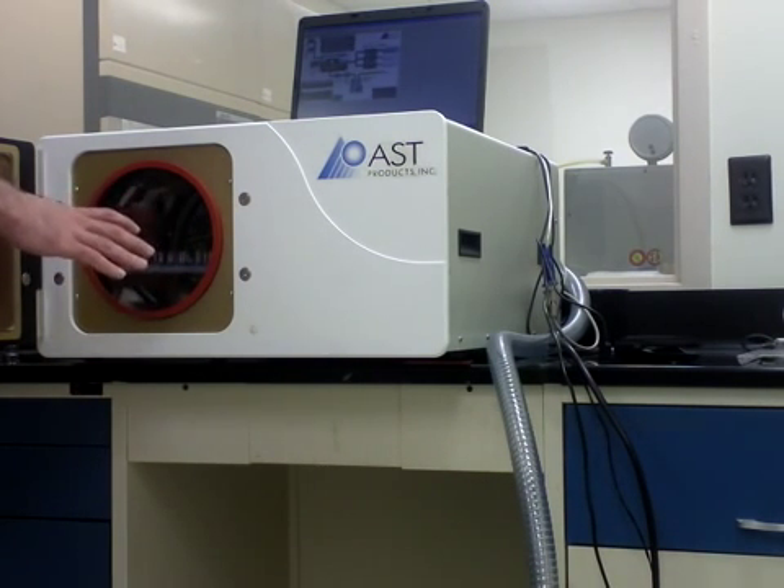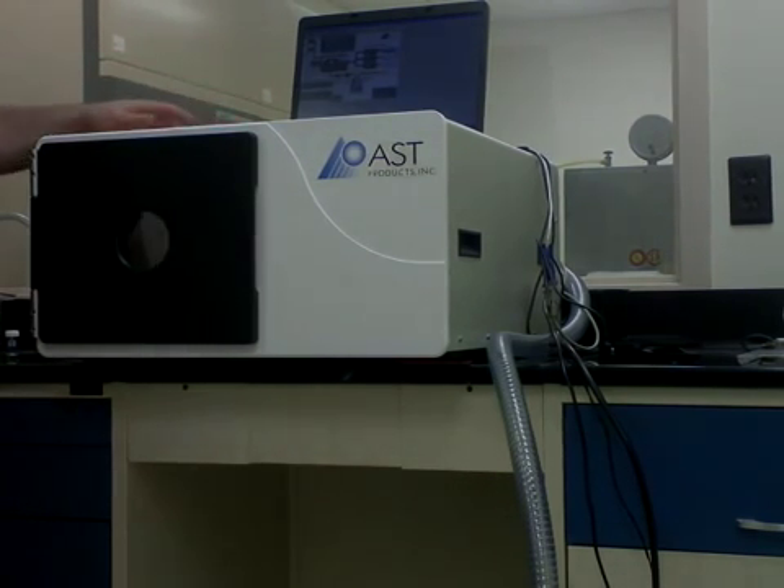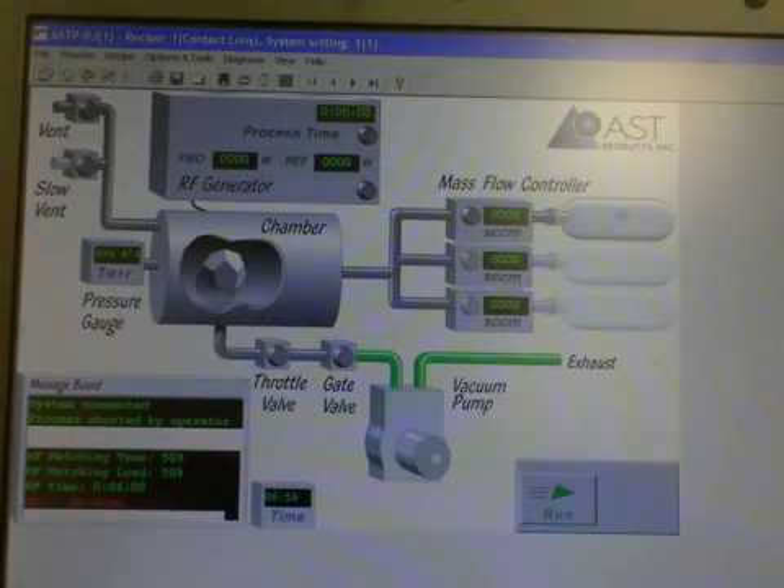The tray sits right in the chamber. Close the door and then go to the software. This is the software for the PJ plasma system — it's a very user-friendly, easy software to use. We're not going to go into a lot of detail today; this is just the basics of how to run the software.